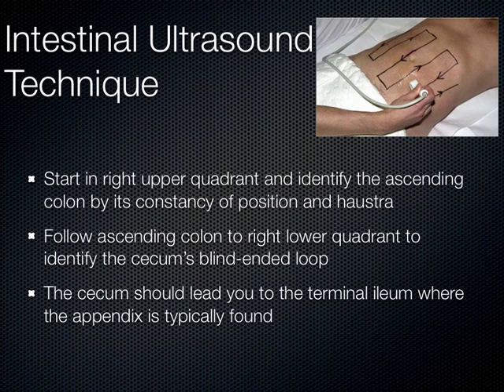Now, if there's air in the colon and the small bowel, it's very difficult, if not impossible, to see. You have to do a really active compression of the intestine in order to see the walls. But when there's fluid there, which is especially true in disease states, then we can see the haustra versus the plicae very easily.